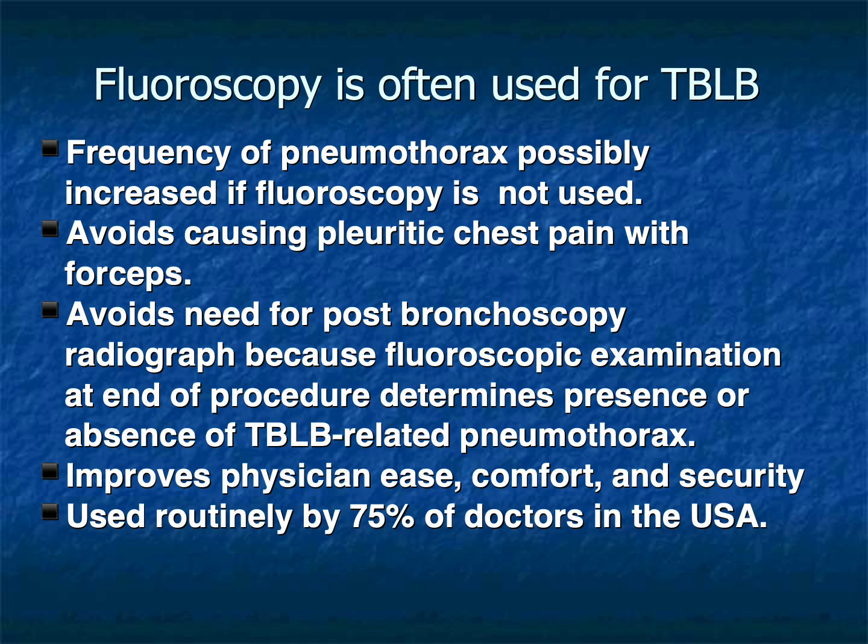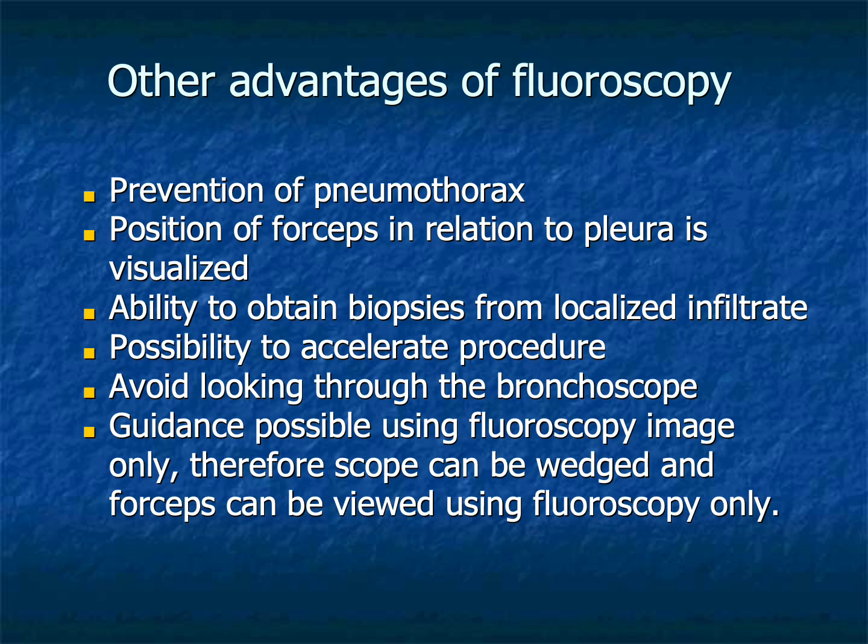For many bronchoscopists, fluoroscopy has become an important safety tool. By directly visualizing the biopsy forceps relative to the pleura, fluoroscopy decreases uncertainty regarding forceps position and may reduce the risk of pneumothorax. It also allows sampling of localized infiltrates, facilitates efficient positioning of the bronchoscope, and often eliminates the need for routine post-procedure chest radiography.